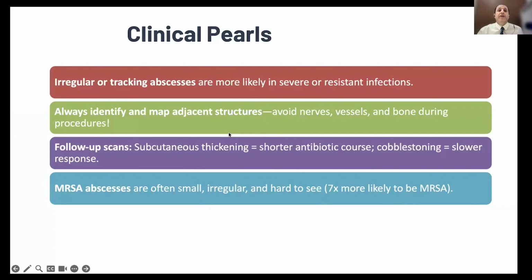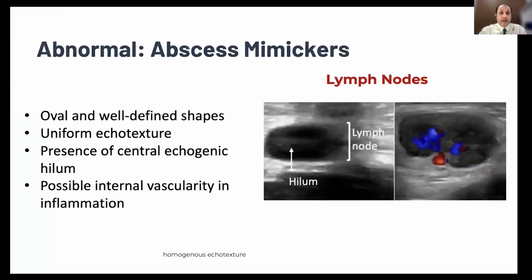So doing point of care ultrasound is not just for finding pus under the skin. We can use it in our diagnosis, in our procedures, even in choosing the best antibiotic for the case, and in following the case safely with point of care ultrasound.